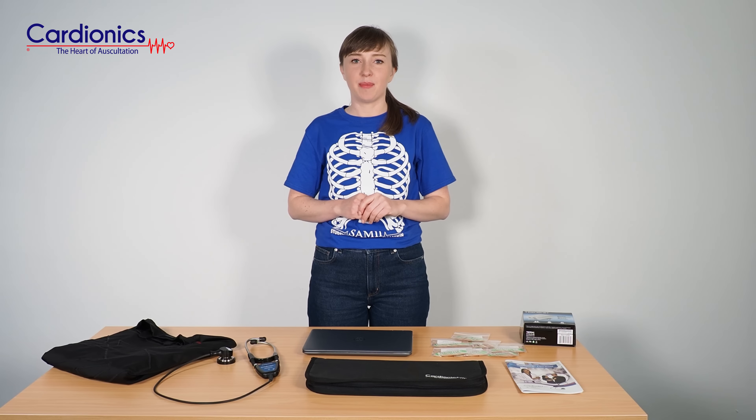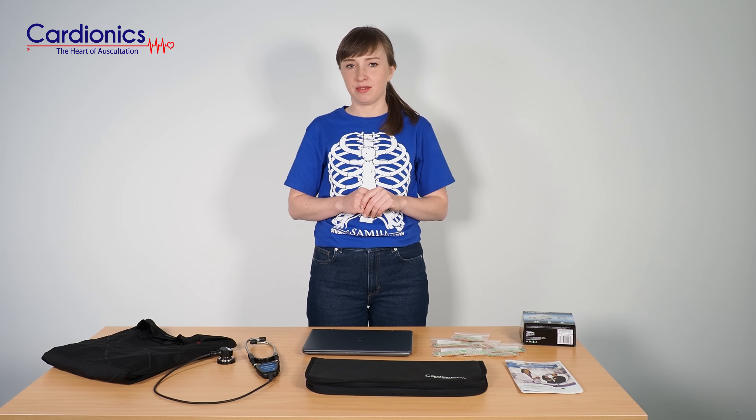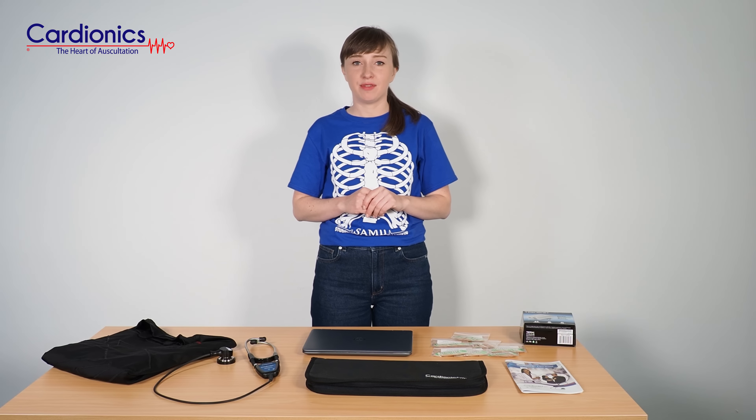Welcome to the Sim Shirt out-of-the-box video. Sim Shirt comes with the following components which give you a complete solution to your auscultation training. Once you unbox your Sim Shirt, you'll find the following.